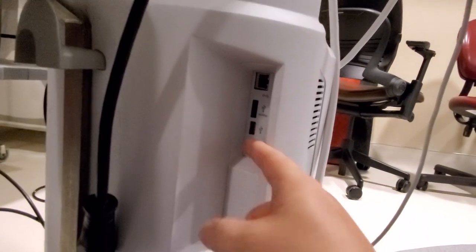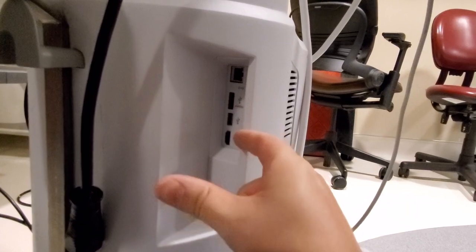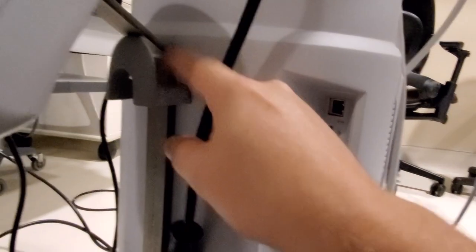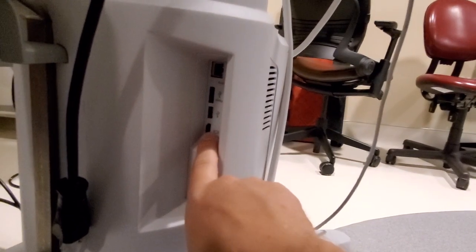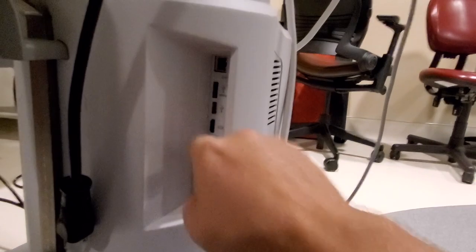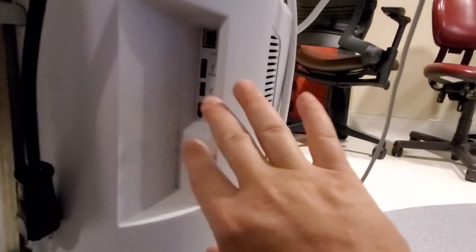So if you have video connections that come off of your device, try and use an extension, which is about 6 inches to 3 feet long. And I would fasten it right here. And that would be the point where my users would plug and unplug from the machine. Try to minimize people constantly unplugging stuff at the main board. This is the point that will break, guaranteed. And you're gonna save so much money if you keep people from doing that.